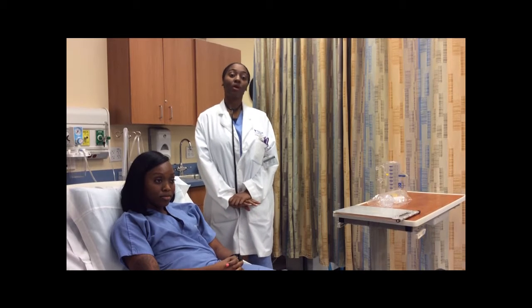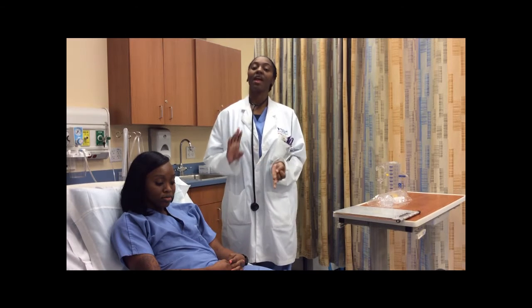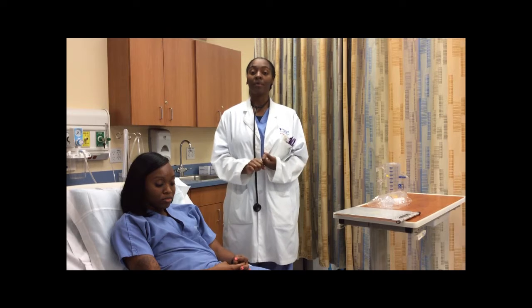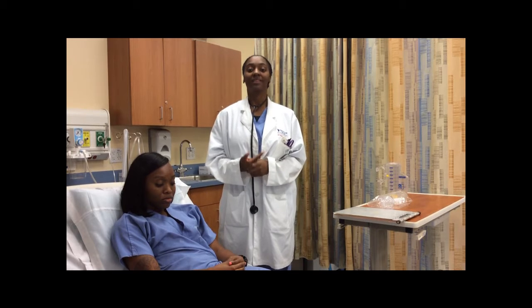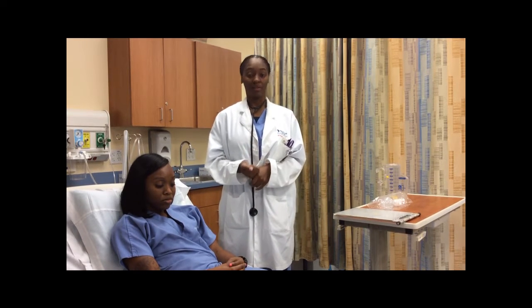Indications for incentive spirometry are patients who had surgery, COPD patients who had surgery, upper abdominal and thoracic pain, upper abdominal and thoracic surgery, spinal cord injury, abdominal binders, restrictive lung deficit, atelectasis, and prolonged bed rest.